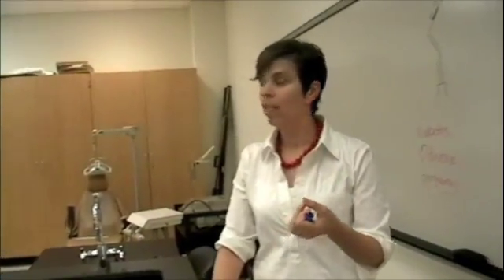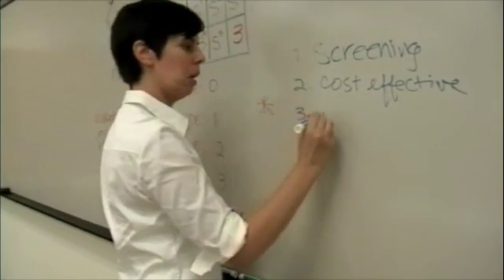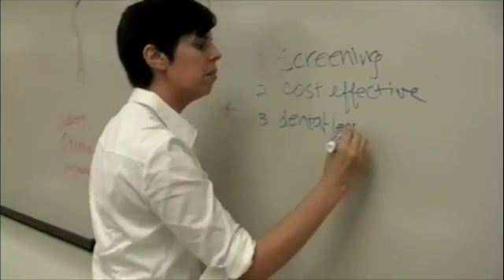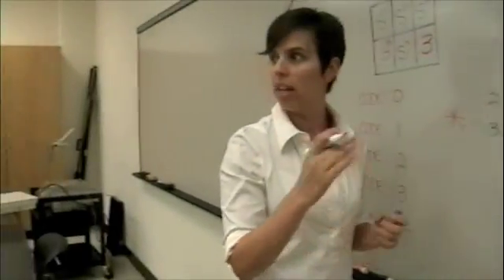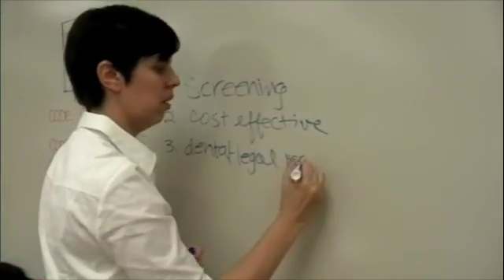You don't have to do a whole lot of recording. It also does satisfy the dental legal requirements, and that's a big one. Because it was developed by the ADA and the AAP, they're doing it as the standard of care, so you can use this to satisfy your dental legal requirements.